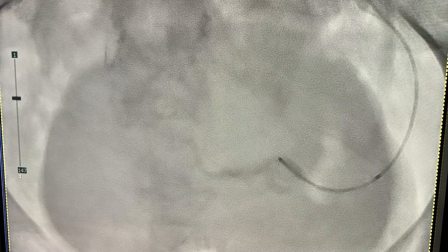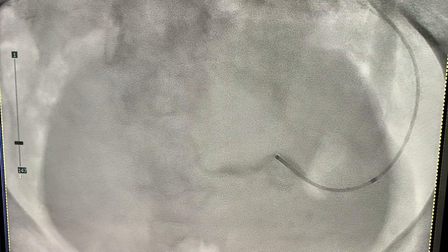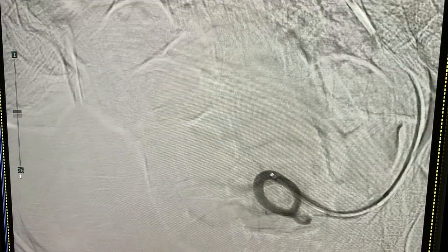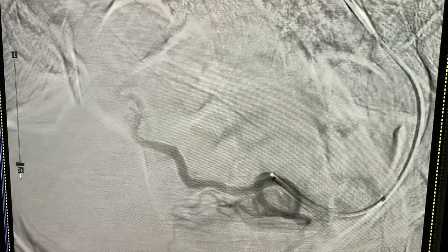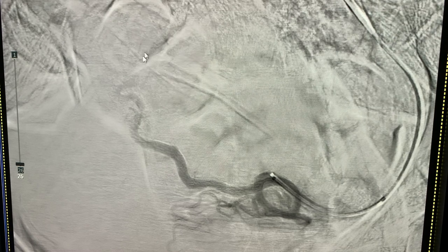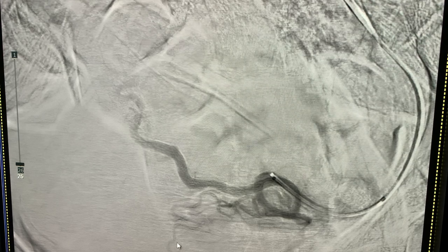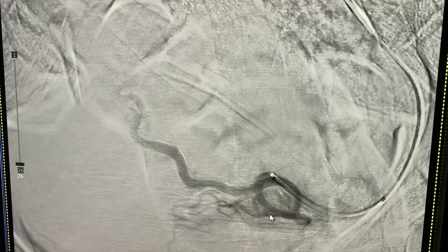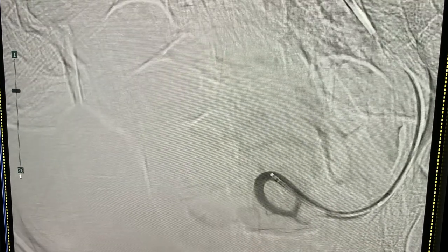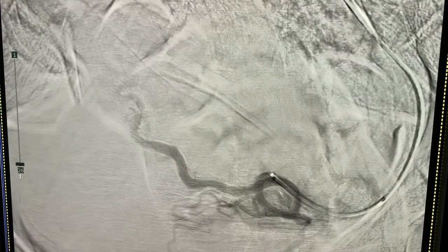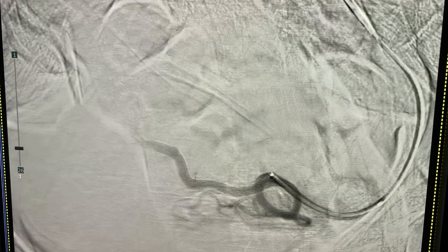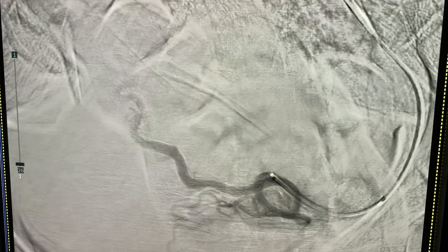You can see here that the flow is beginning to slow down and the more distal hypertrophied branches are no longer visible. After embolization, the flow is very slowed down and the hypertrophied branches in the distal portion are gone. Importantly, the cervical vaginal branch going more inferiorly is still patent — you want to keep that patent so the patient doesn't experience unwanted pain or bleeding — while the hypertrophied branches supplying the fibroids are in complete stasis.